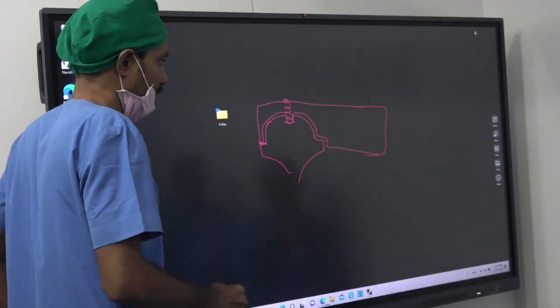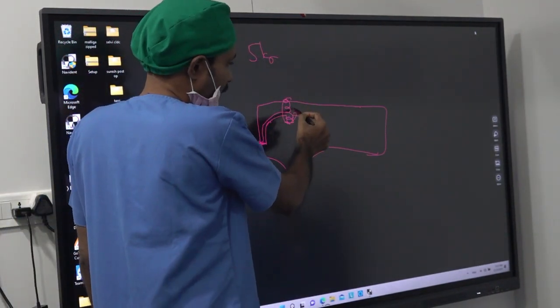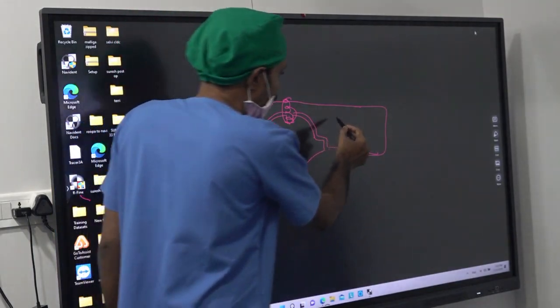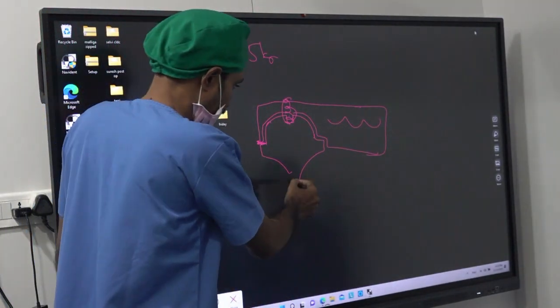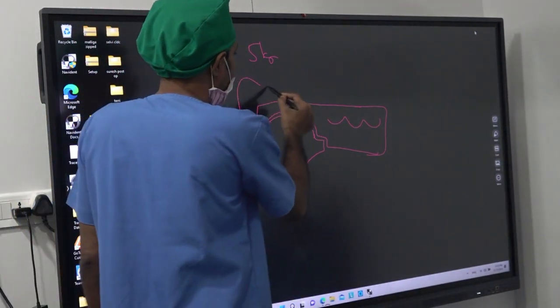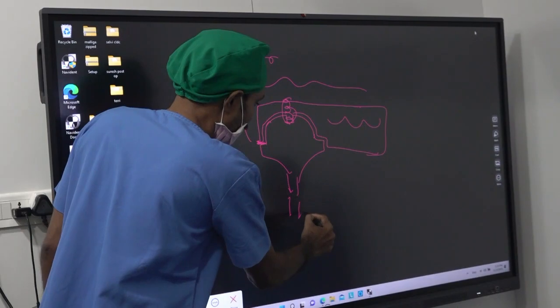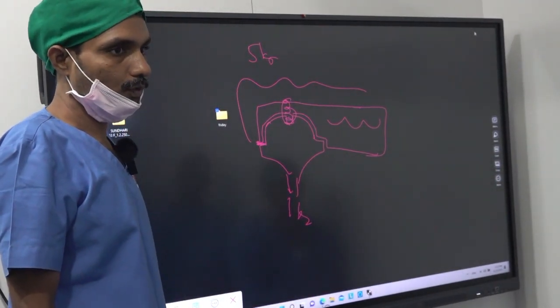So what is the advantage here is, when the patient is giving 5 kg, some forces are nullified by this screw, some forces are distributed over this finish line, this margin, and some forces are distributed within the titanium frame, and only the remaining forces are going to the bone. And not only that, upon this we are going to do the process. Over the process, some amount of forces are going to get used. So finally only 1 kg will go to the implant and bone. So the healing will become beautiful.